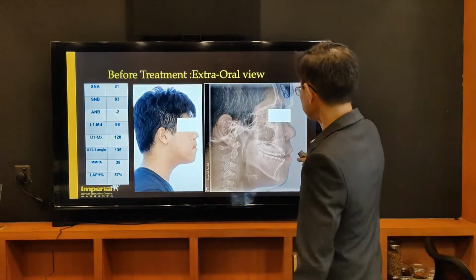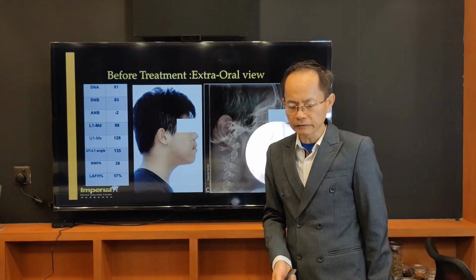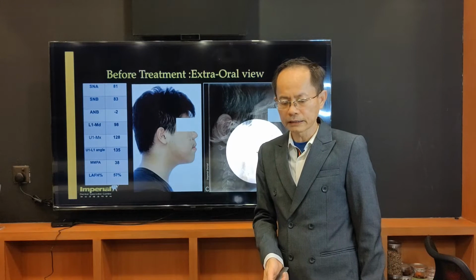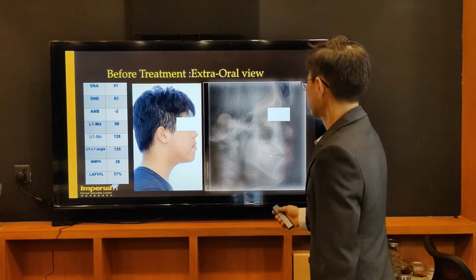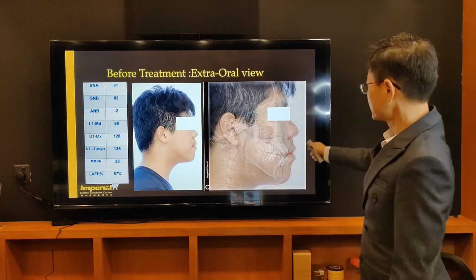The AI helps us match the relationship of the teeth, the lips, as well as the lower jaw, upper jaw, and the temporomandibular joint. From here, the computer gives us a series of figures. This is the x-ray analysis traced by the AI.